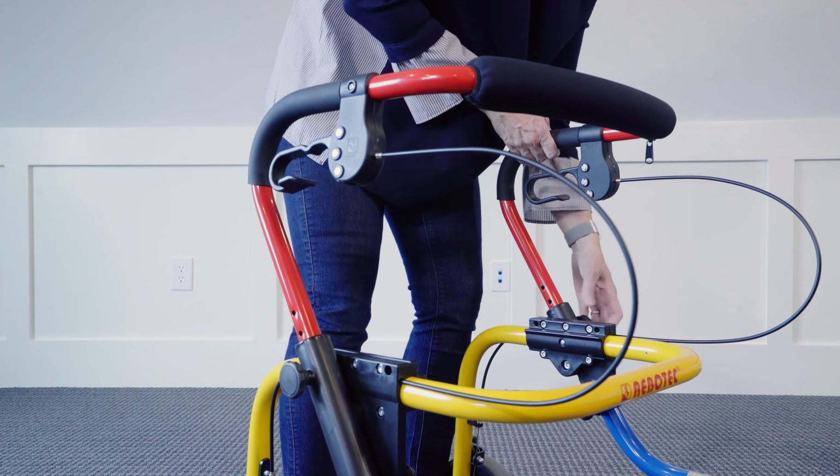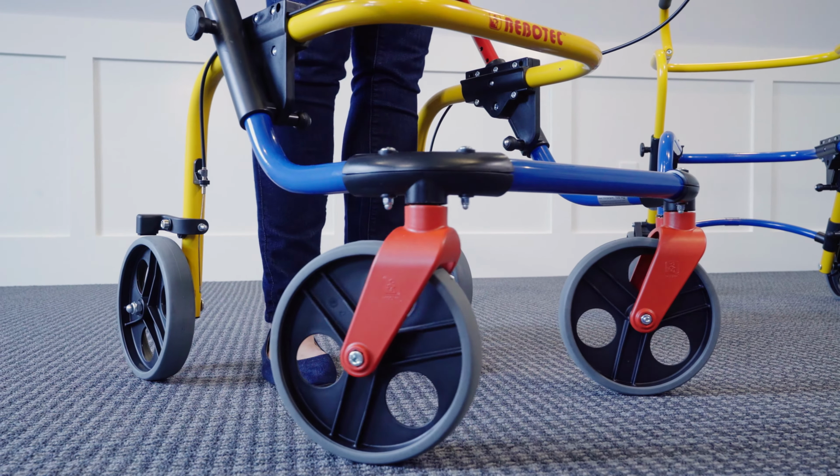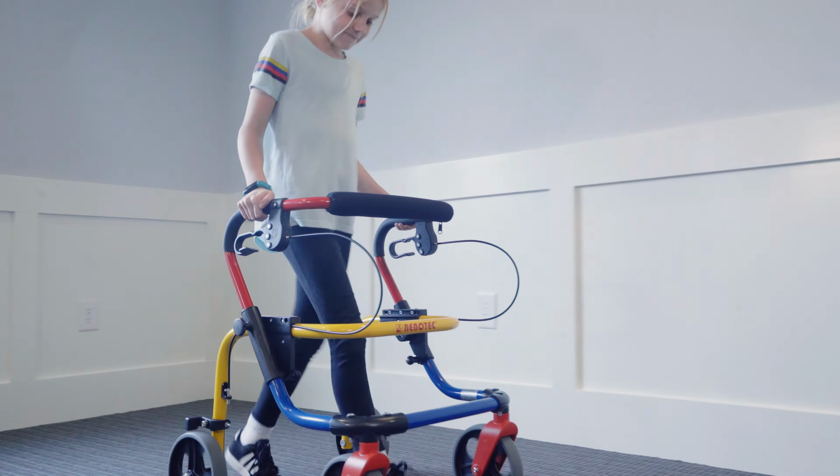Here we go. It also has the 360 degree swivel anterior wheels, which is super nice. They don't lock though, so if you have an ataxic patient that can't control all that freedom, this would not be a good walker for them.